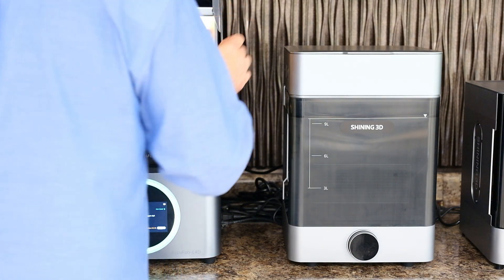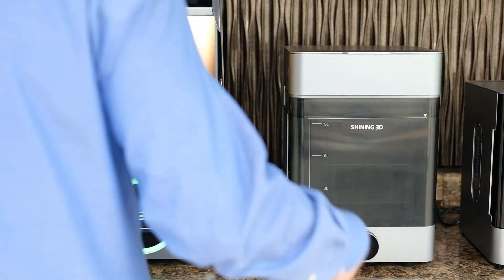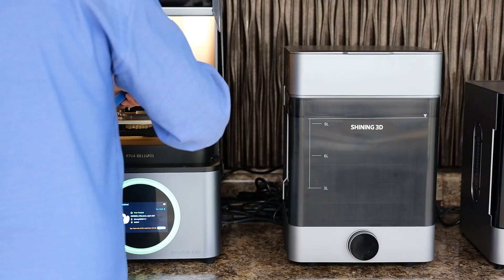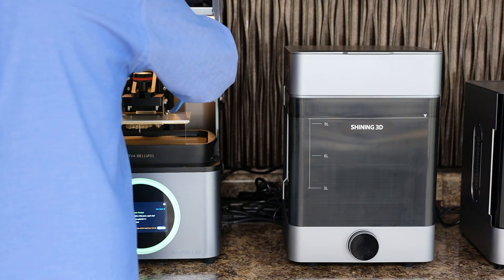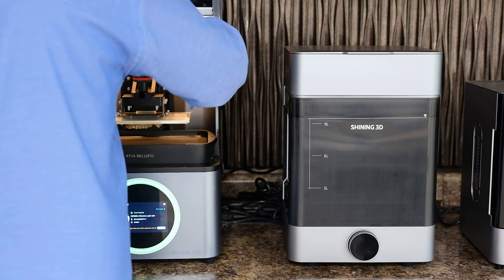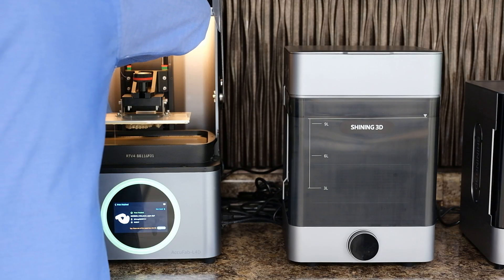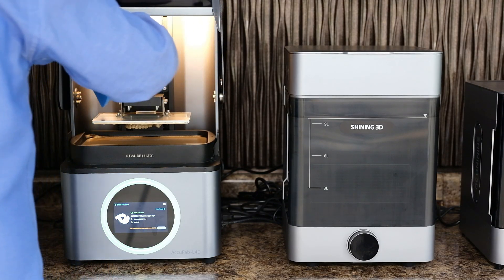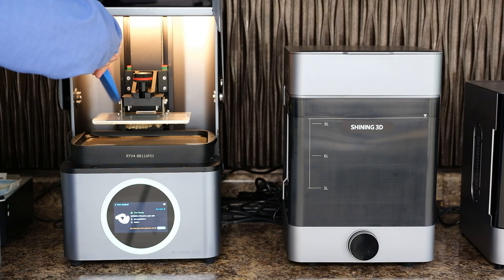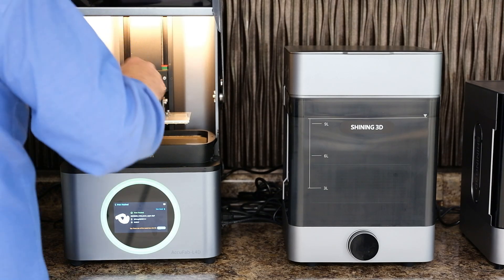Now that the print is complete, we can go forward with removing the print base. I use the silicone paddle that comes with your printer to clean all the resin off the top so I can get it back into my tank. There's no need to waste that resin and dirty up your alcohol with it. By taking a few moments to wipe the top, you can preserve a lot of resin and also preserve the life of your alcohol wash.